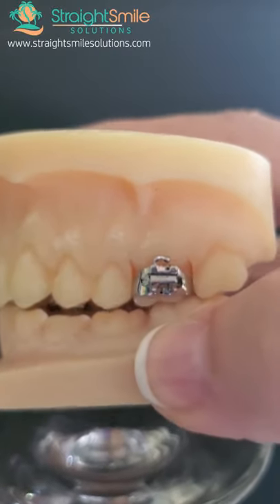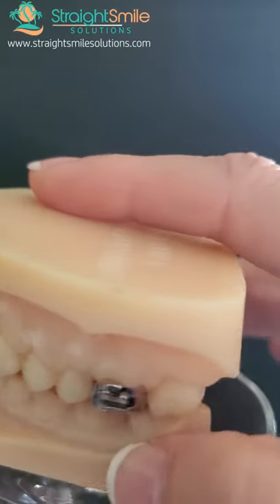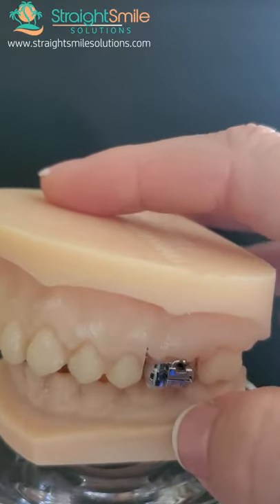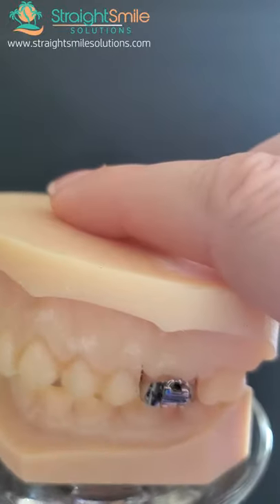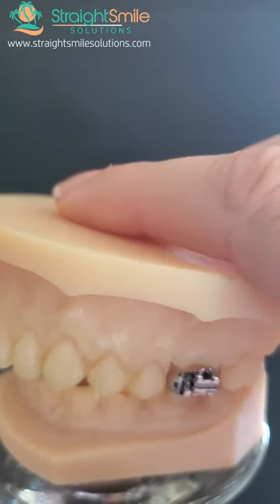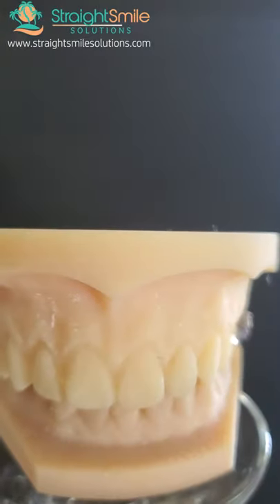You can see right now the bite is open. Until all the teeth are occluding — you can check with articulating paper — the appliance stays in on both sides. If patients want to speed it up, they can wear their box elastics. If this is phase one and you don't have brackets on all the teeth, just let it settle on its own.